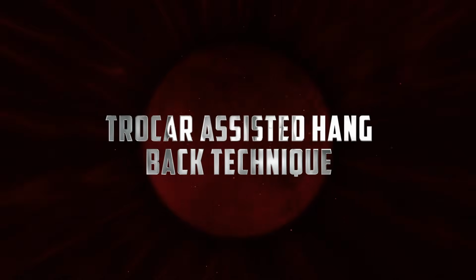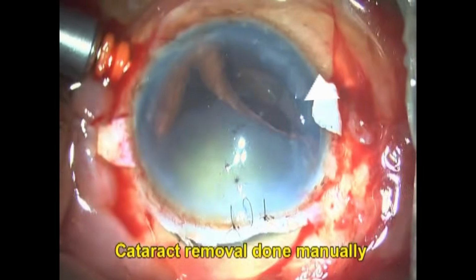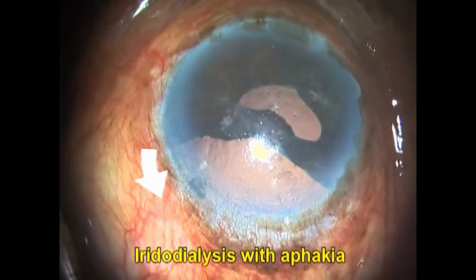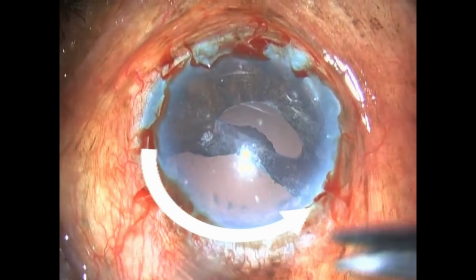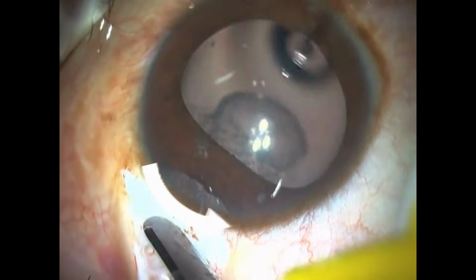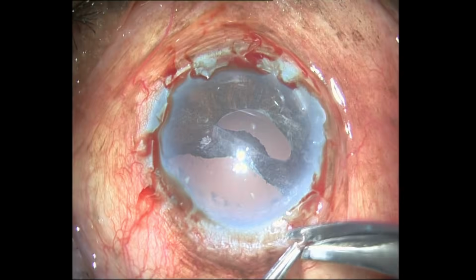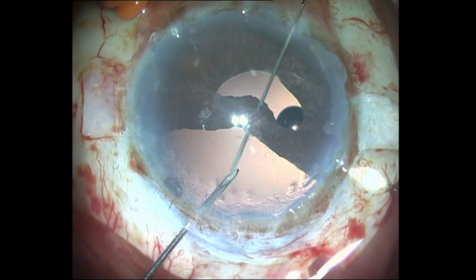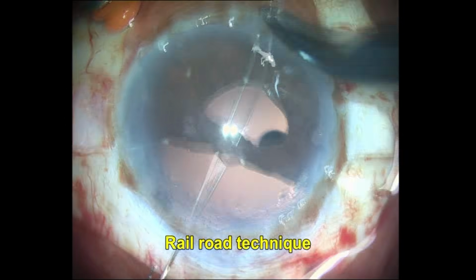The trocar-assisted hangback technique. Iridodialysis is classified as massive, more than 120 degrees, moderate, which is between 45 and 120 degrees, and minimal, less than 45 degrees. Always remember to create a scleral pocket in the area of the dialysis and a clear corneal incision opposite to the zone of your dialysis.